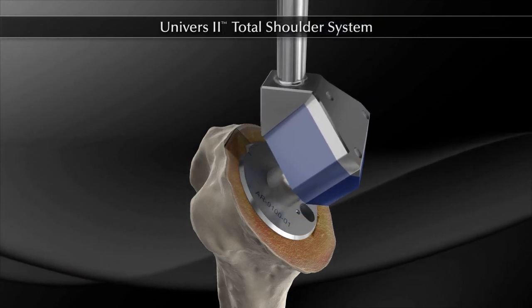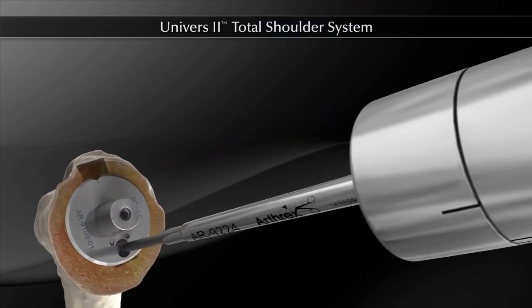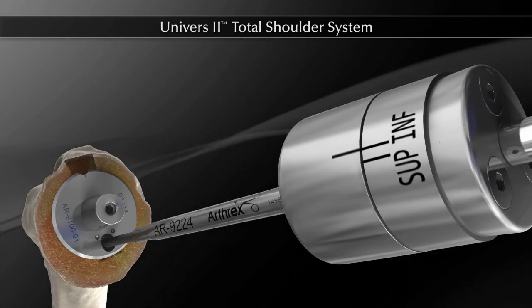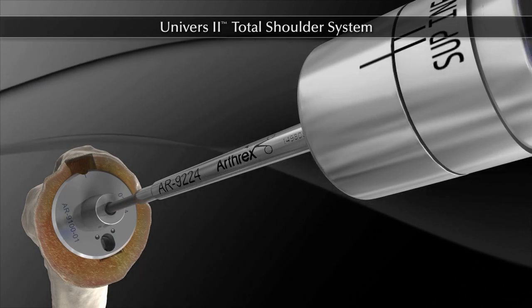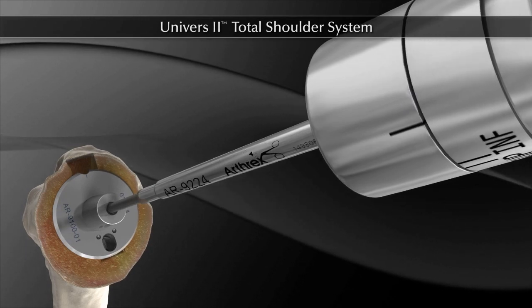The inferior locking screw on the medial portion of the trunnion is tightened by visually confirming the INF mark is rotated past the indicator line on the torque driver. Next, the torque driver is used to tighten the version screw located on the Morse taper by visually confirming that the SUP mark is rotated past the indicator line on the torque driver.